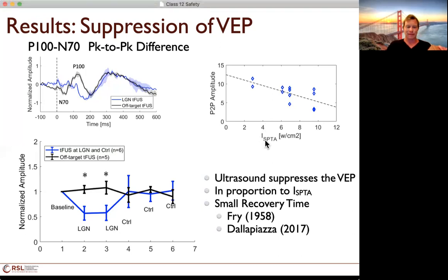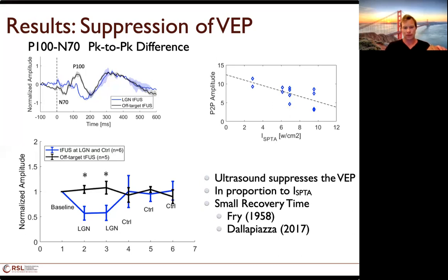So you could easily have changed this to ISPPA as well, because since the timing was the same, the ISPPA would be higher when the ISPTA is higher.